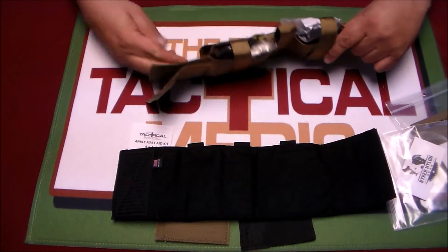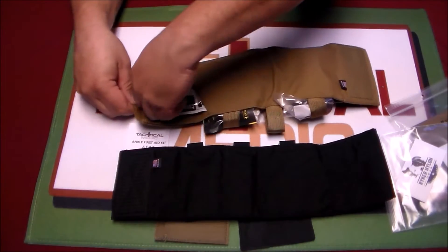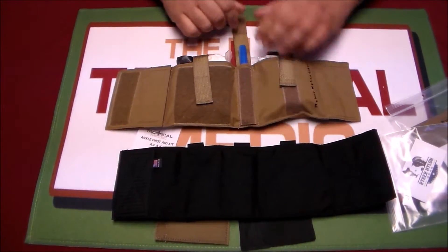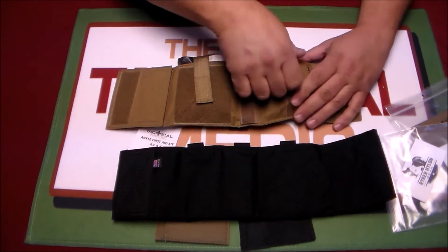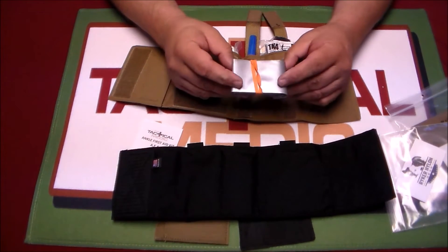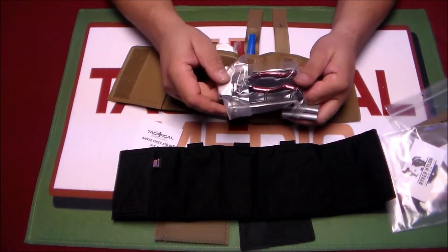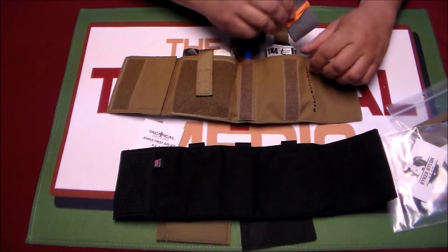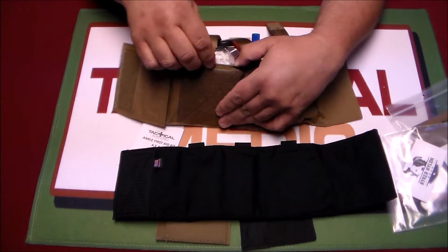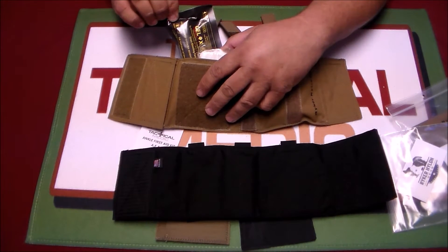Our stocked version ships with the North American Rescue Compact Hi-Fin. We also ship a 14-gauge decompression needle, the H&H Flat Packed Combat Medic Tape, the TK-4L tourniquet, the WoundStop Israeli Bandage, and a dose of Celox Rapid.